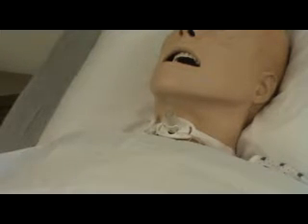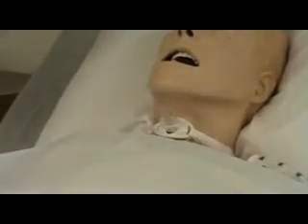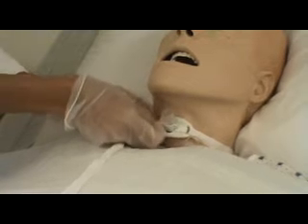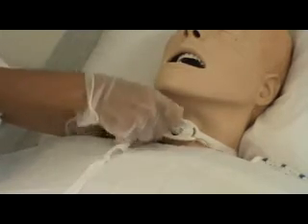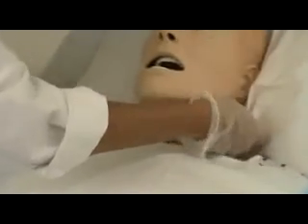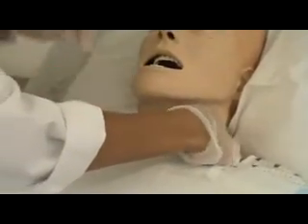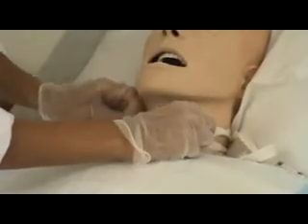Next I'm going to change the trach tie. You don't want to remove the old trach tie until you have the new trach tie secured. I'm going to tie it on this side first, go in on this side. This is the tricky part — until you're halfway, then you'll have the patient sit up, or in this case I'm going to go around my patient. Some people use the handle end of the cotton swab if their fingers don't allow them to push that end through very well — just a tip.